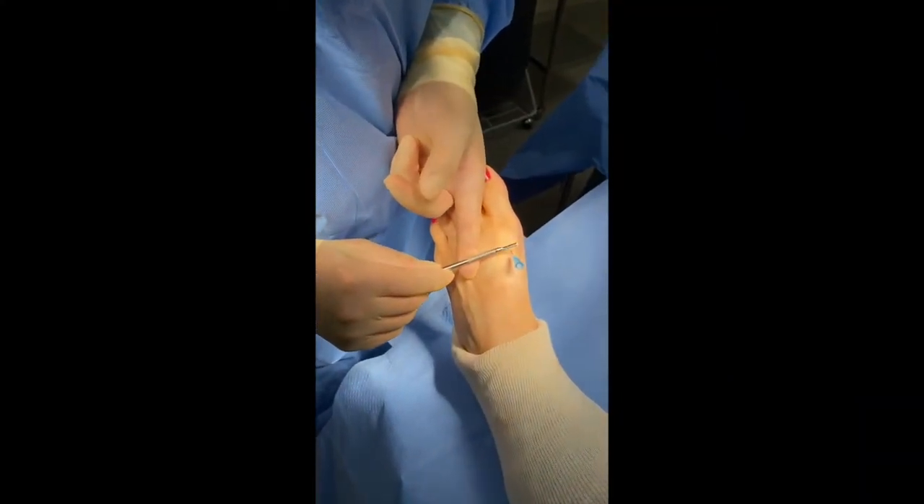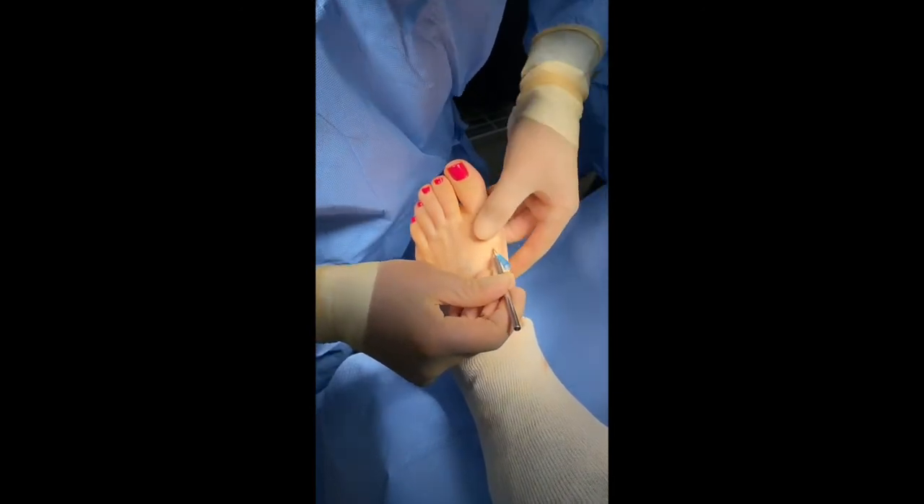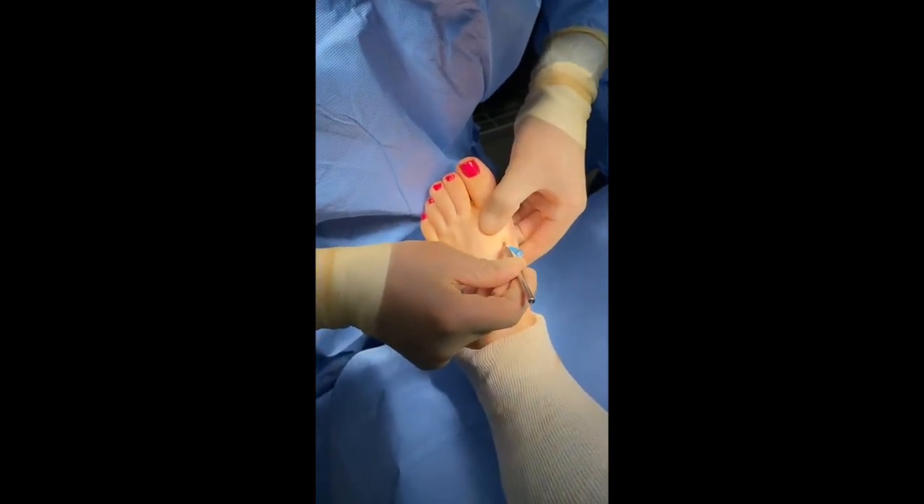We'll take this 64 beaver blade — it's a very tiny blade, probably three millimeters. We make a little poke in the skin and go straight down to the head of the screw.